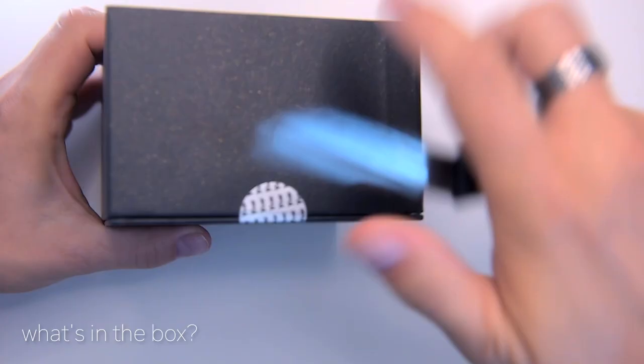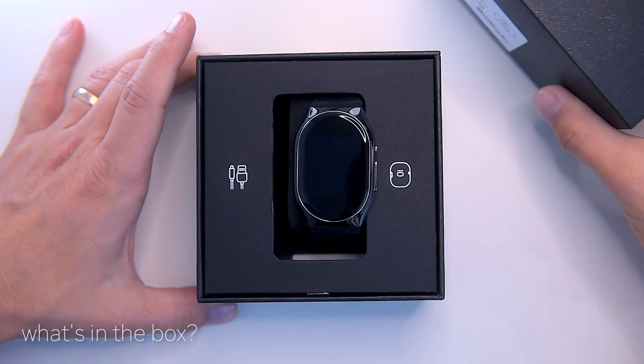In the elegant looking box we can find the watch itself, a small charging dock, a micro USB cable, manuals, a warranty card, and a wrist diameter tape to help you get the right fit.